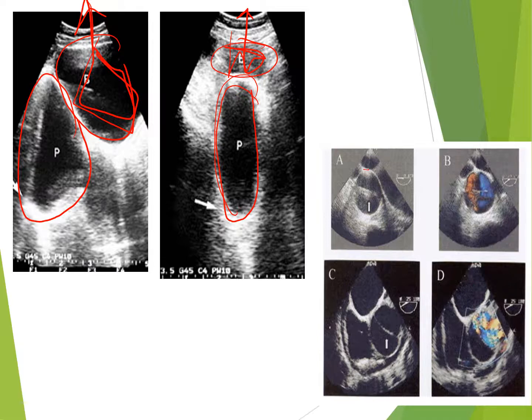Because of that multipath, we're going to get this kind of weird structure that pops right up in the middle of our aorta, and it can be easily confused with a possible intimal flap. So it's important as sonographers that you try different windows, try coming at things a different way to see if that is a true anatomical problem or is it just an artifact.